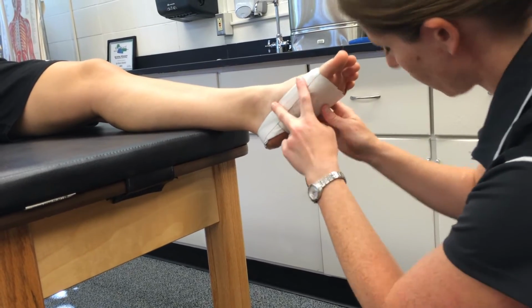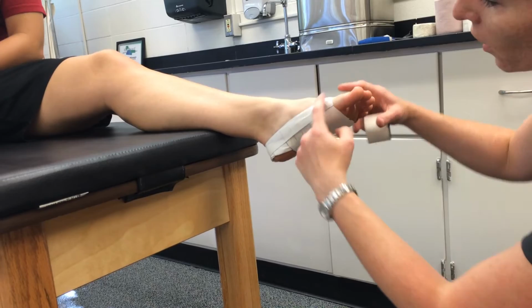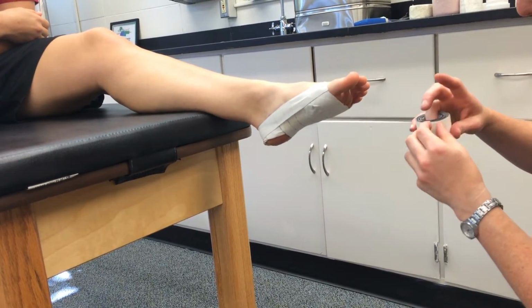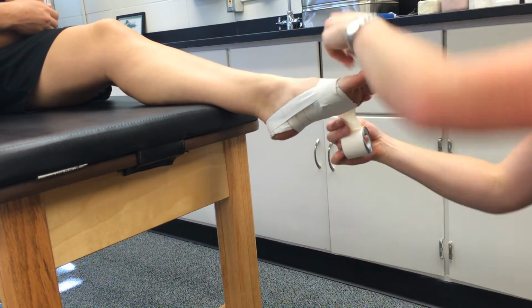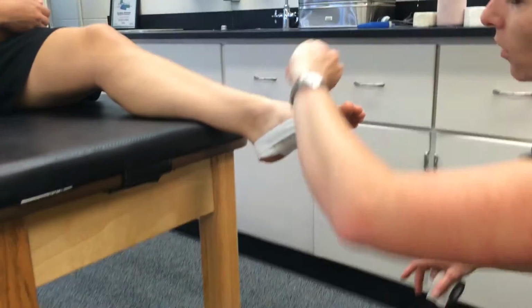So that is the end of the functional part of this taping technique. There's a couple things you could do. Because this has a tendency to slide down, you could leave it just like this. Some people will then just put 1 strip on the top side to anchor and keep those tops from going. So that would be one way you could do it.